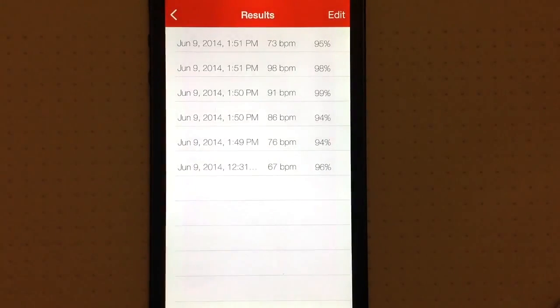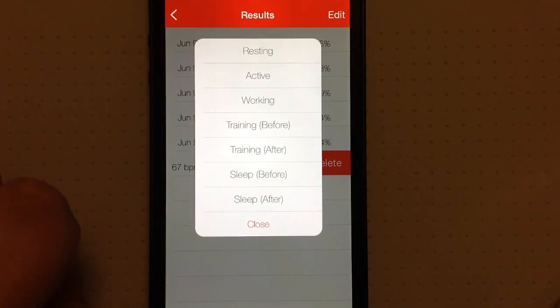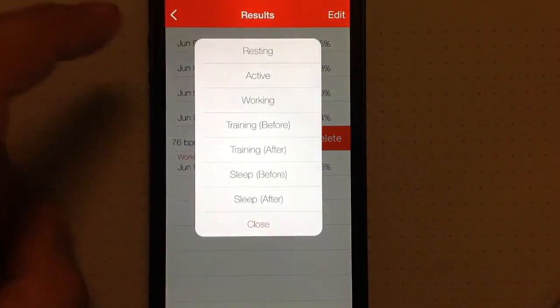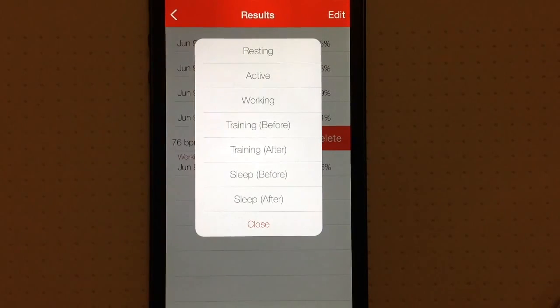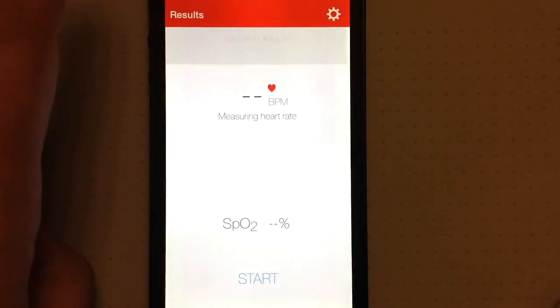One thing Pulse Oximeter does show you is it keeps a log of all your measurements. If you swipe over, you can add labels to your log — so we'll say we were working. One thing I would like is custom notes, because you're only limited to the labels that are built into the app. If you like to take measurements before or after medication or during different activities, you're not able to do that right now, so custom labels and notes added to your log would be fantastic.